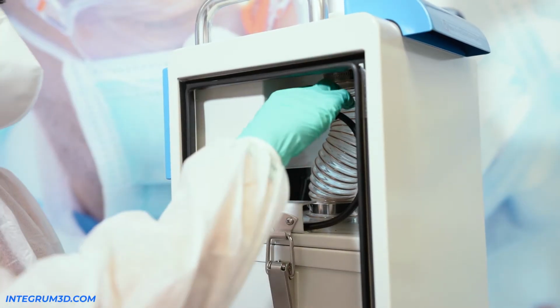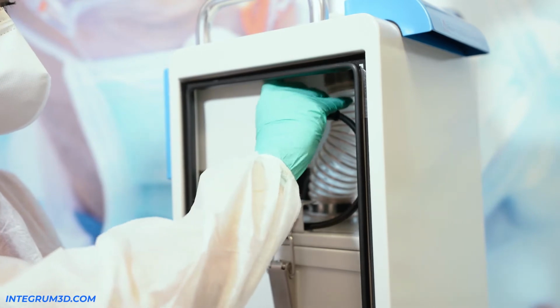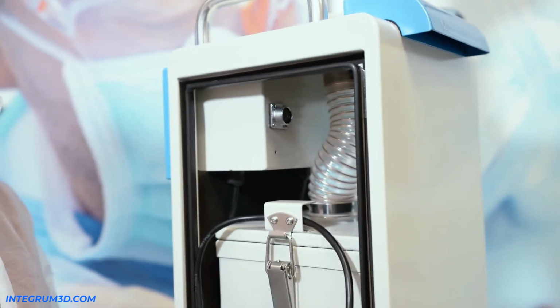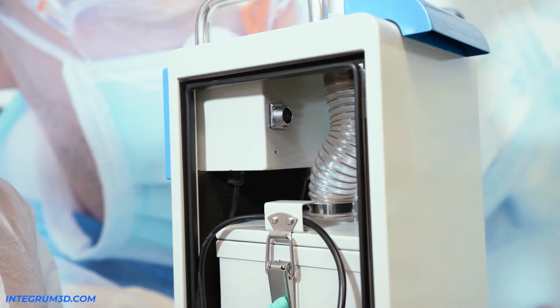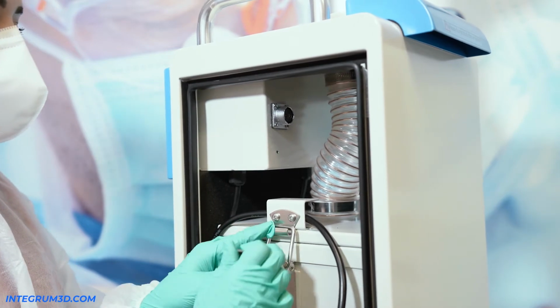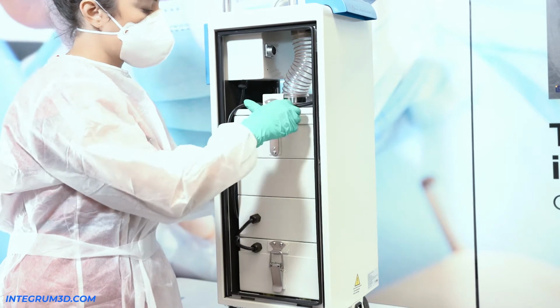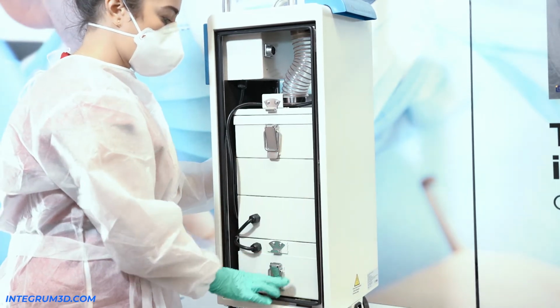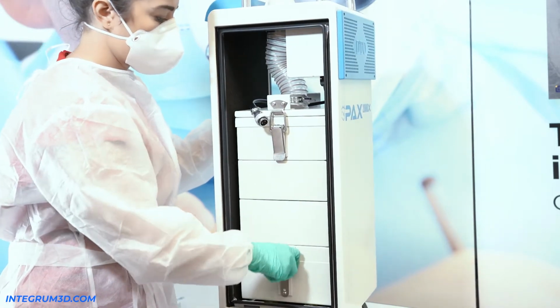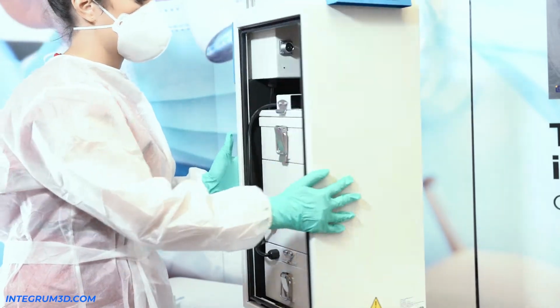You're going to unscrew the main power cord that's connected to the machine all the way, and then pull it out. Make sure this is disconnected. Then you're going to unlatch all 4 latches on both sides. So you want to remove all 4 latches on the box. There's 2 more on this side as well. We're going to do these. And we're ready to change our filters.